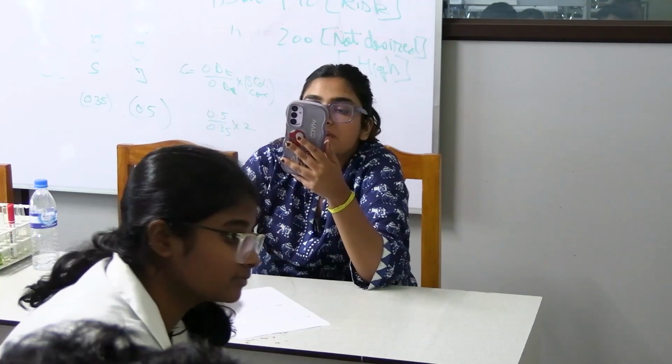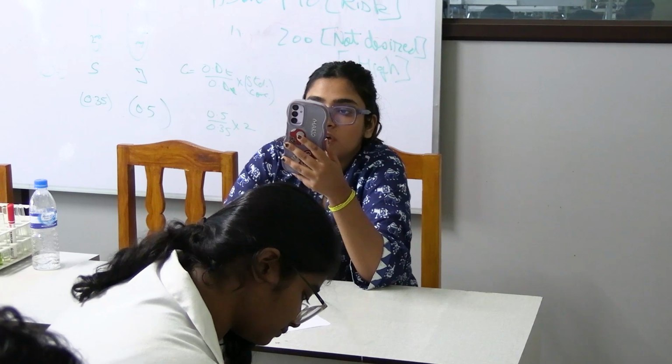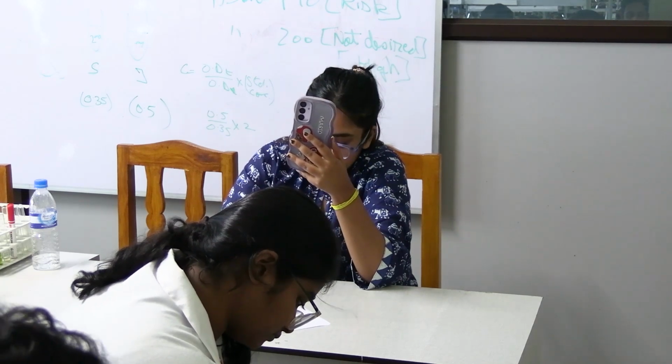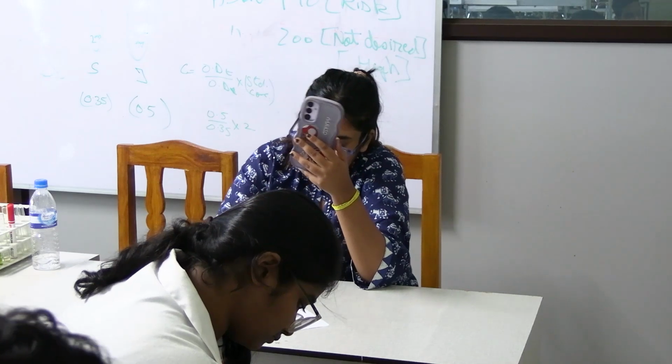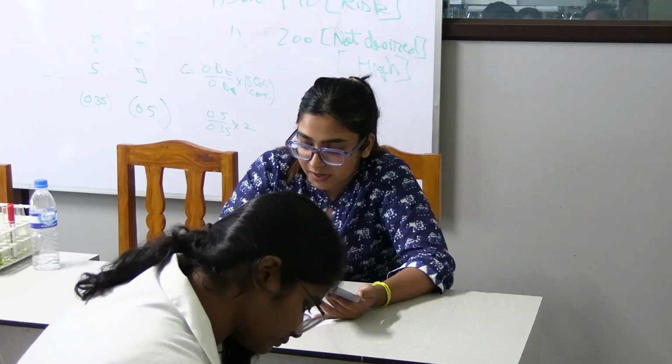Okay. 7.41 is the pH. PCO2 is 41.4. Bicarb is 26.1. pH is 7.41. Nothing is wrong with this pH. Nothing is compensated. His ABG is fine. This is a normal ABG.